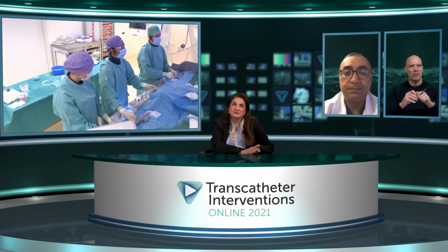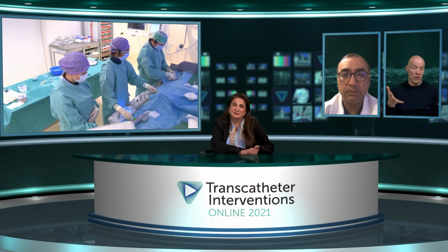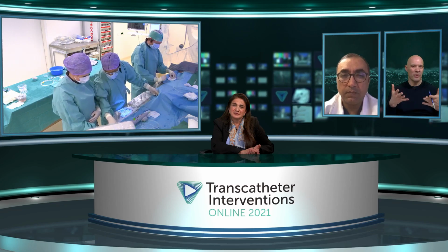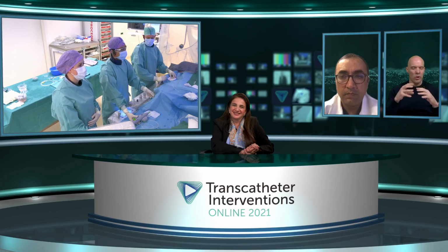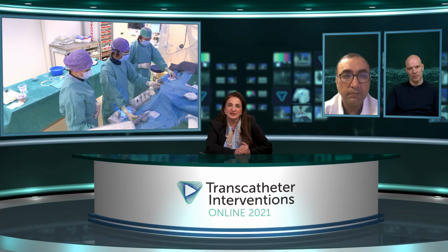So I would agree with Joost that an atherectomy device would be more appropriate in this particular setting, because you have a very long lesion with multiple segments, and we are also learning how to use orbital atherectomy at this stage in Europe, because we only did the first European case 2 months ago in Erasmus. But apparently you not only work on the superficial calcium, but also on the calcium in the media using orbital atherectomy. So this is, I think, an additional advantage of this kind of technology. There's no question. I think it's a beautiful way.